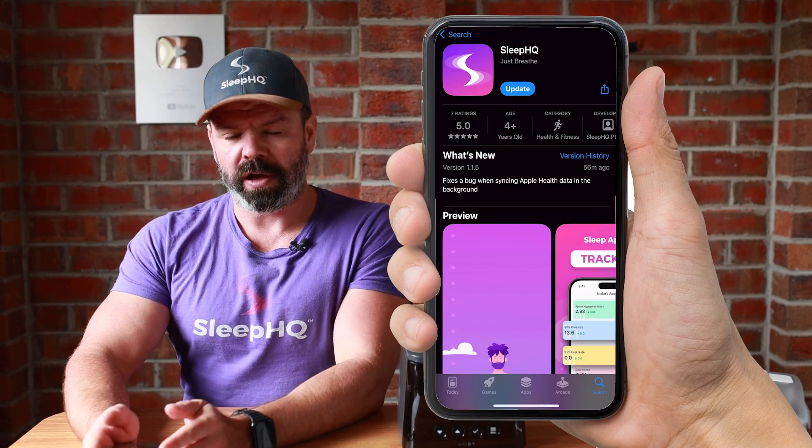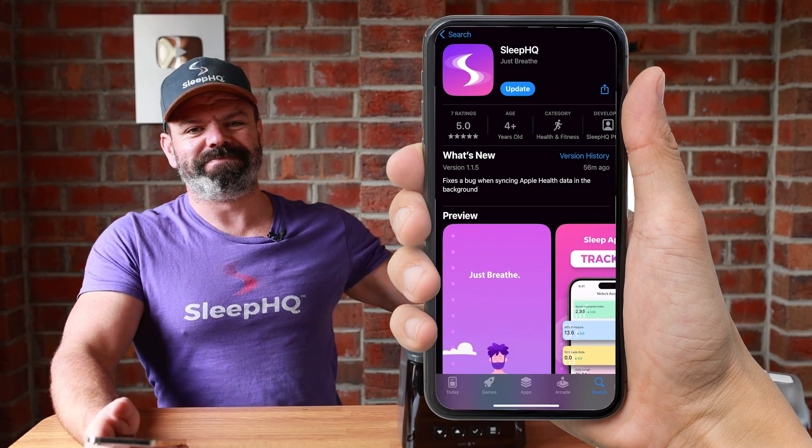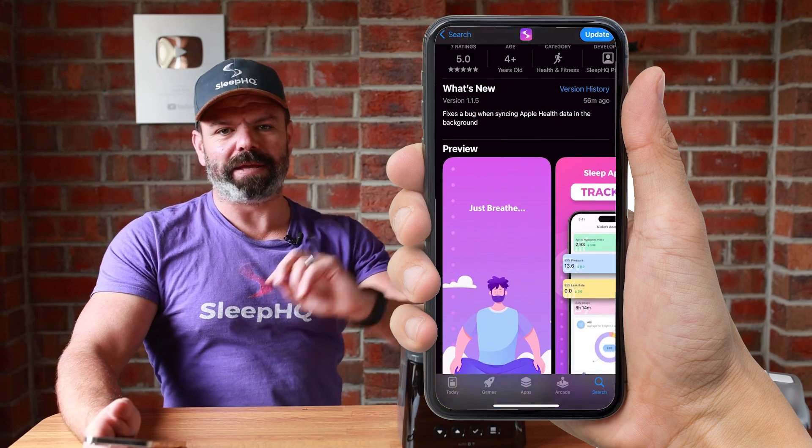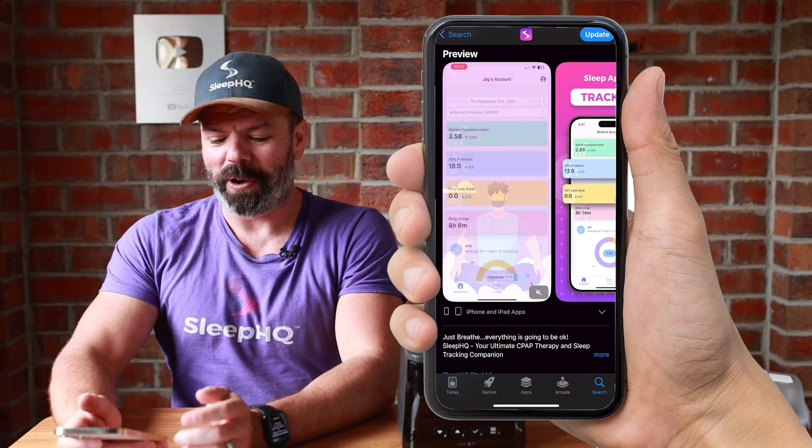Today I'm going to show you how, using the SleepHQ.com app. That's my app — let's do it. Step one: download the SleepHQ iOS app from the App Store. Click the link above, and give it a great review while you're there.